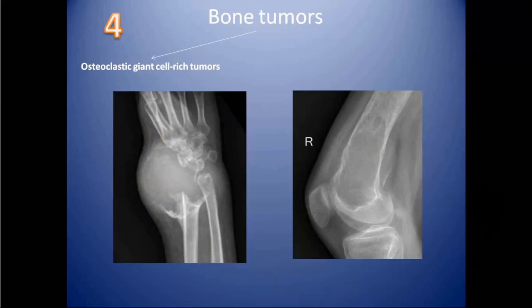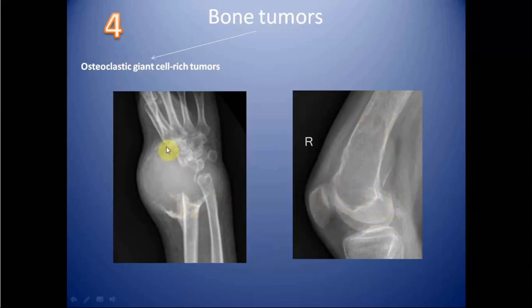There are four characteristic radiographic features of giant cell tumor. First, the patient has a closed growth plate — as we can see in this patient, the growth plate is closed. Second, the lesion abuts the articular surface — as seen here, it is abutting the articular surface. Third, it has a non-sclerotic rim — here you can see there is no sclerosis in the rim. Fourth, the lesion is eccentric and expansile.